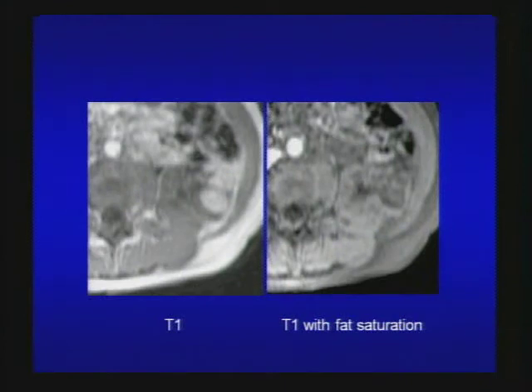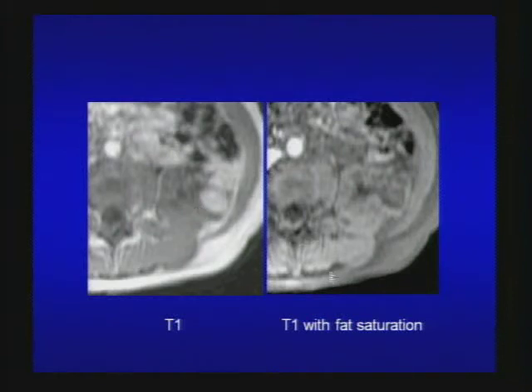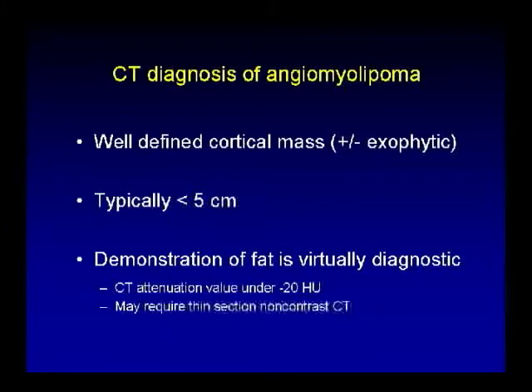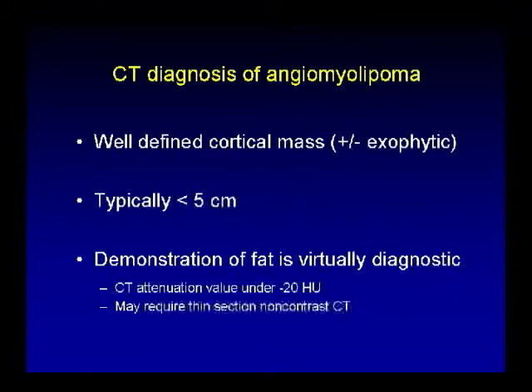Here's a case on T1 without and with fat saturation. On the left you see a T1 hyperintense mass arising from the left kidney, and on the image with fat saturation there is drop of signal consistent with fat — this is renal angiomyolipoma. CT diagnosis of AML: a well-defined cortical mass, typically less than 5 cm, and macroscopic fat is virtually diagnostic. CT attenuation of fat should be minus 20 Hounsfield units and may require thin-section CT.